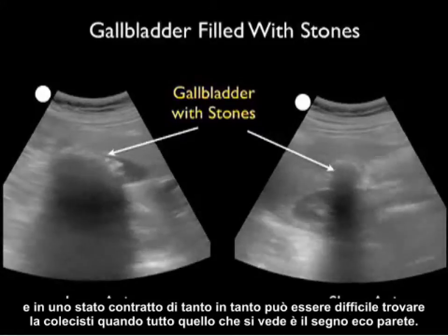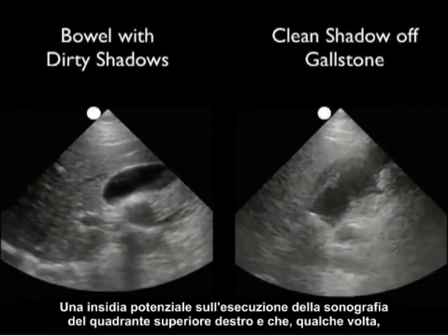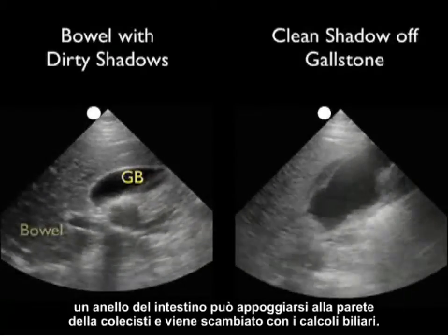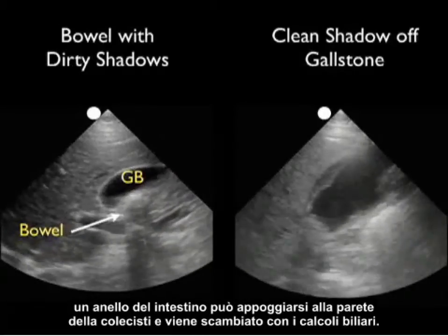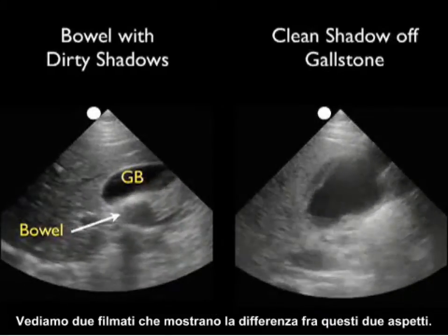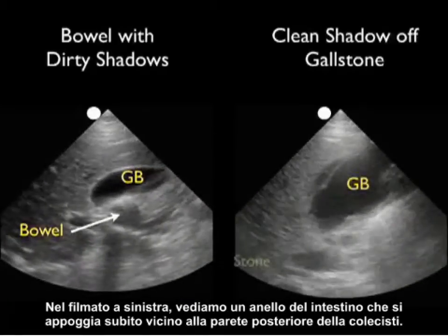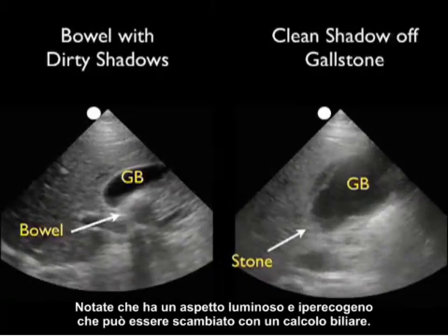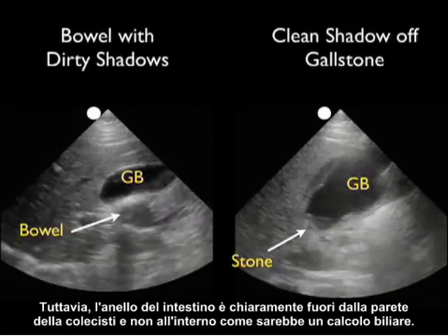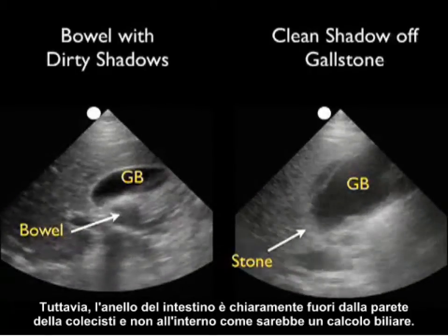One potential pitfall in right upper quadrant sonography is that a loop of bowel may come right up against the gallbladder wall and be mistaken for a gallstone. In the left video clip, we see a loop of bowel against the posterior wall of the gallbladder with a bright hyperechoic appearance that could be mistaken for a gallstone. However, the loop of bowel is clearly outside the gallbladder wall, not inside as a gallstone would be.